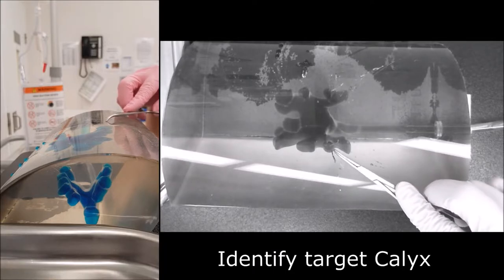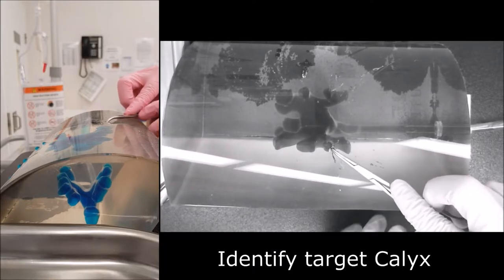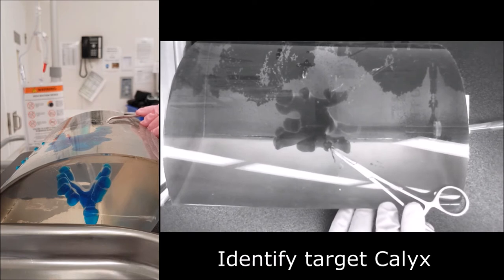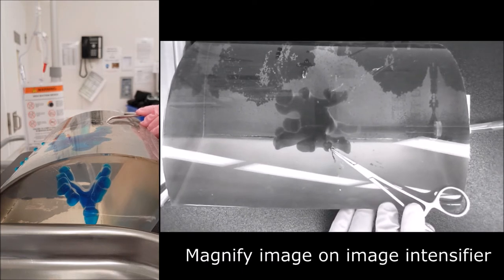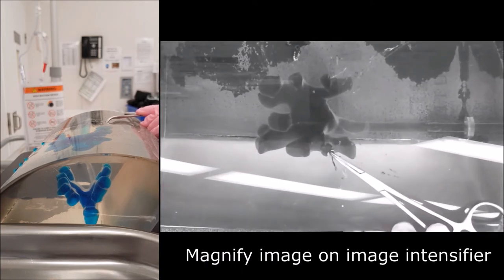Use the image intensifier to identify the target calyx. Center the image intensifier over the target calyx, and then magnify the image.